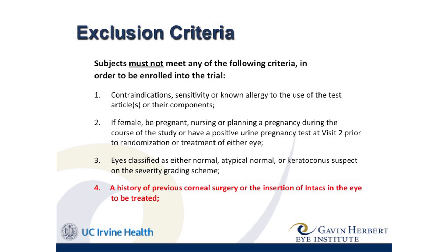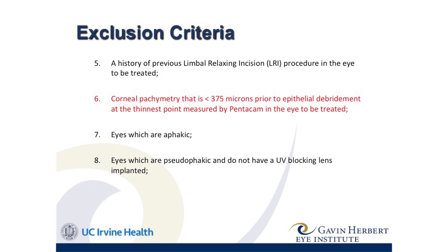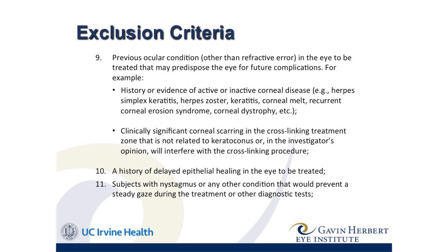And you have to have a certain amount of corneal thickness. I was talking to a family about their son, and they said that his cornea was too thin, and it has to do with the safety parameters for cross-linking and the fact that UV radiation can potentially cause issues, so we want the cornea to be a little thicker. Now, there is some debate on that, and so a lot of this still is to be hashed out. And you can't have any previous infections or significant scarring that may affect the treatment. Also, we get some patients whose eyes are sort of dancing a little bit. It's called nystagmus. You need to be able to focus on the light, which is very important for us to deliver the treatment effectively.